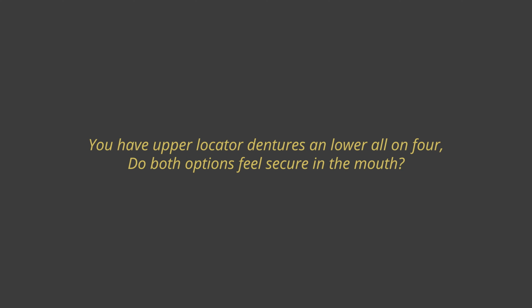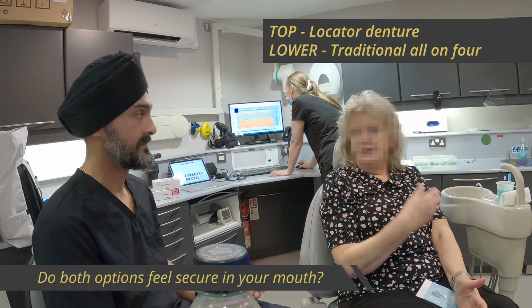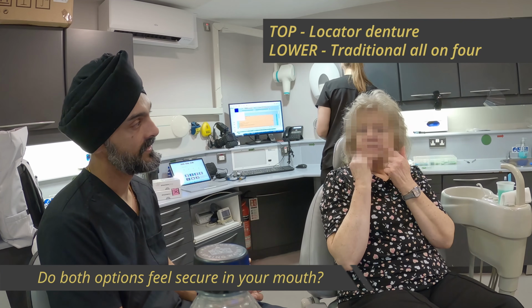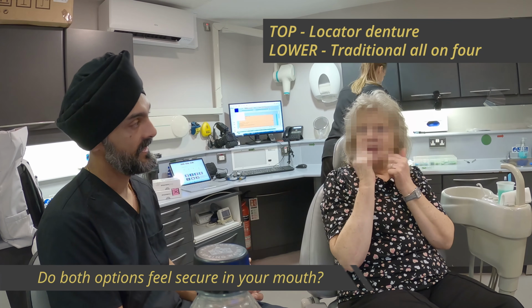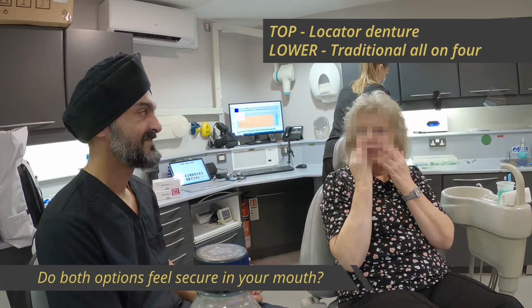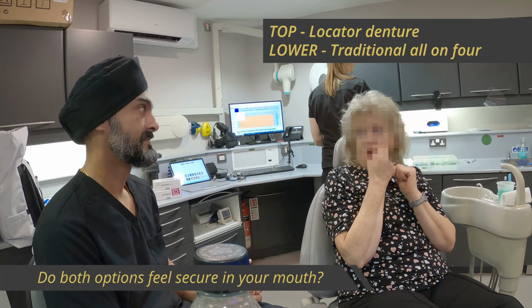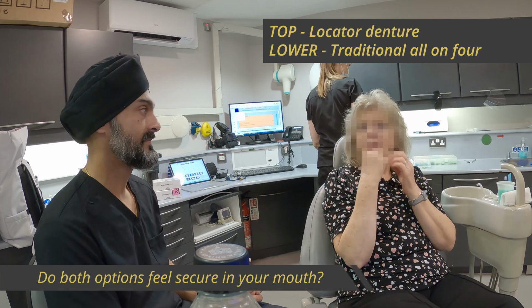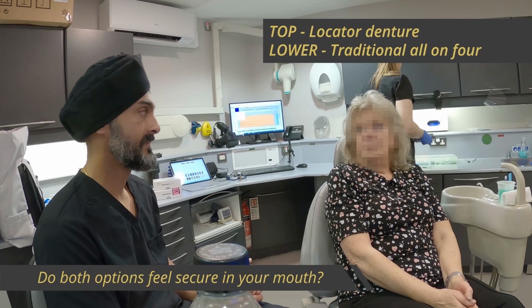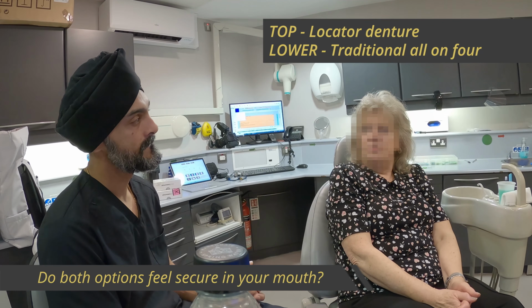The bottom one, I would say, feels more secure because it is. And not the top one. Mine's on a 3 implant, whereas most people, if they can, they'd have 4. So it balances better. But that one with a longer pin felt more secure than the shorter pin. So it can move when I'm eating. I think it depends what you're eating, obviously.